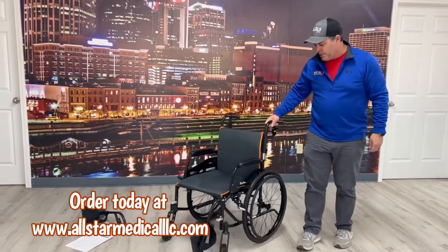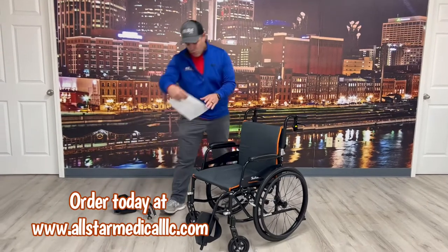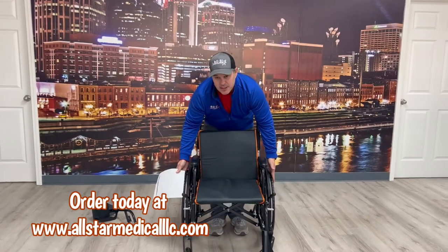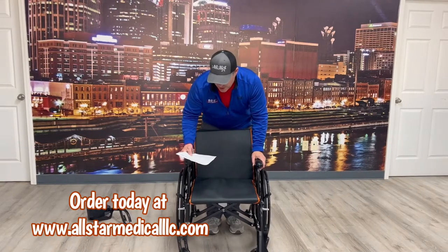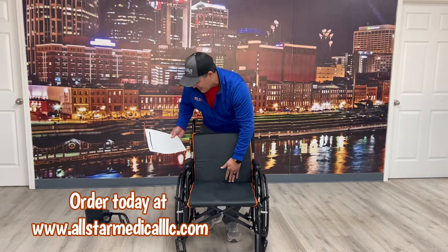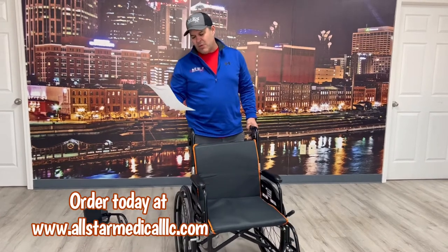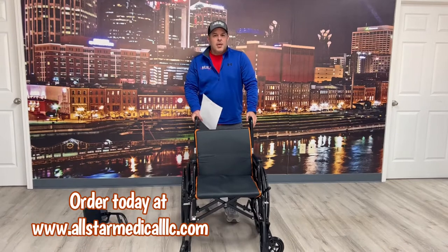This is the Feather Chair with a 250-pound weight capacity. A couple of other dimensions: the overall width is 27 and a half inches, the seat width is 18 inches wide and 16 inches deep. It also comes with a lifetime warranty on the frame and a six-month warranty on the wearable parts.